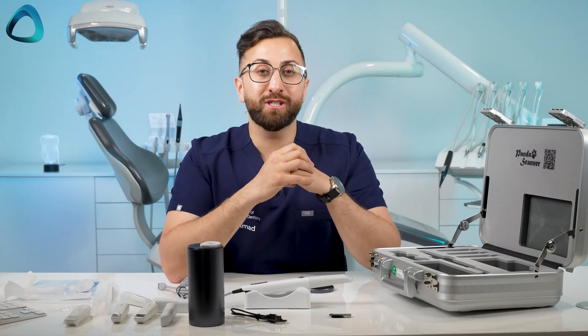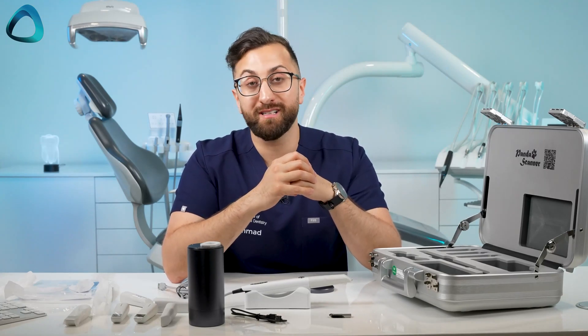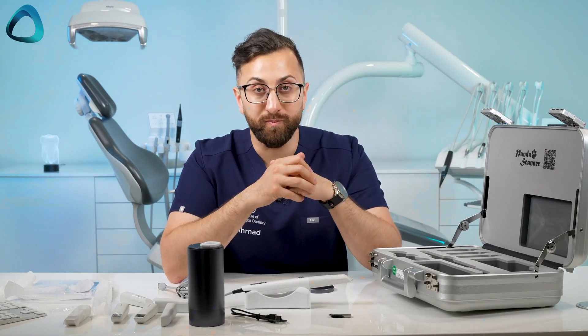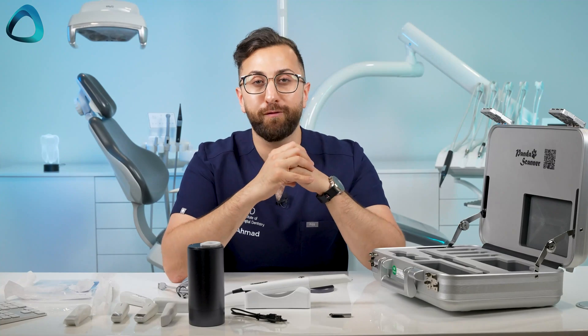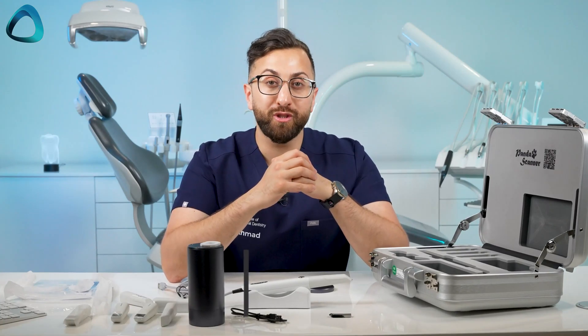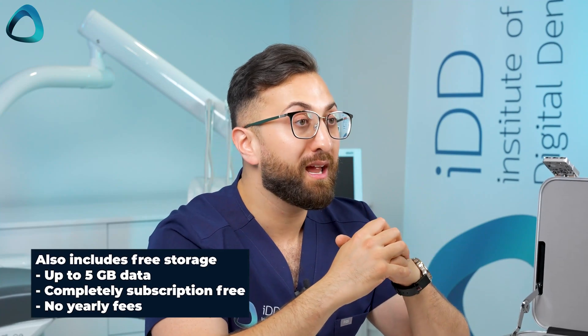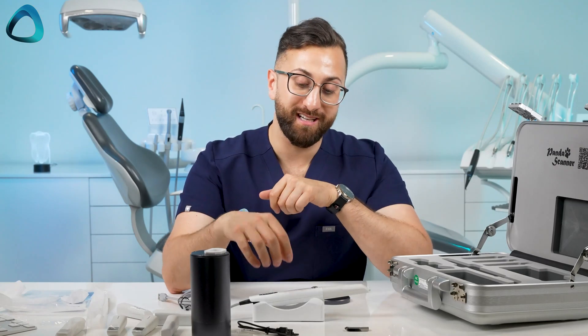Speaking about the software, I'm personally really curious how it is with this scanner, because hopefully we all know by now with intraoral scanners it is a software game — basically every intraoral scanner is fast these days. When I tested the software in the Panda P3 I had a lot of things to tell the company, but when I've seen the scanner showcased at conferences and trade shows, they have made a huge difference to the software. The company tells me the software included is completely free, including free updates. There is also completely free cloud storage for up to five gigabytes of data, with no subscription and no yearly fees.